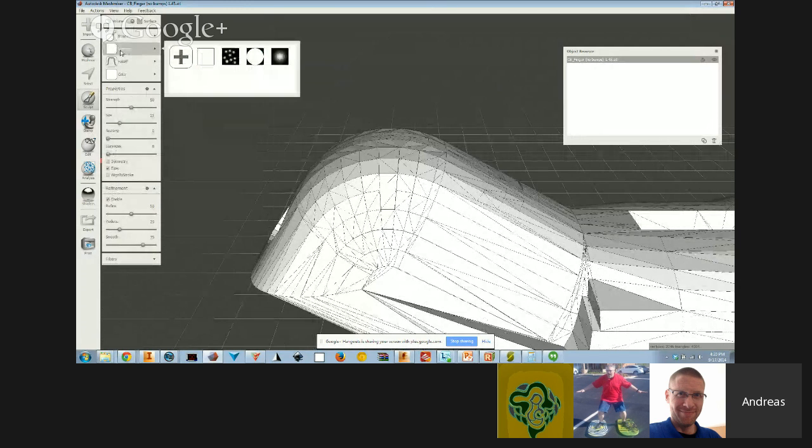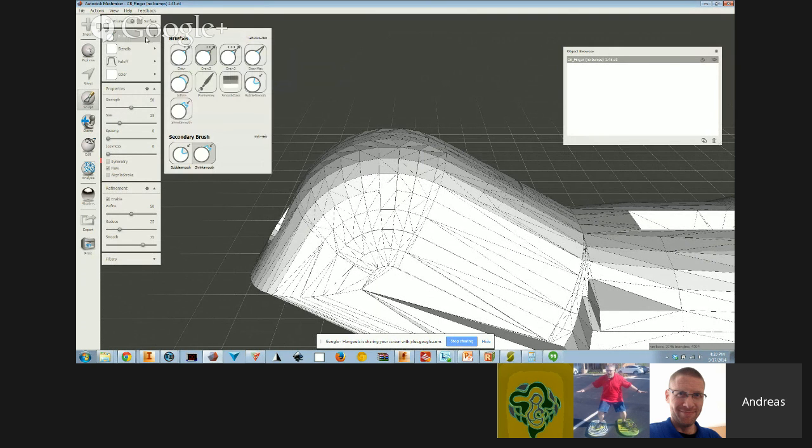Well, let's say I want to use this stencil for my sculpt. When I sculpt, I have a brush that will pull vertices out, and it'll mask the black pixels and pull on the white pixels and use in-between values for the gray. But if I were to do that on this finger, there's not enough pixels. It would just be a couple of things moving, and it wouldn't make a whole lot of sense.